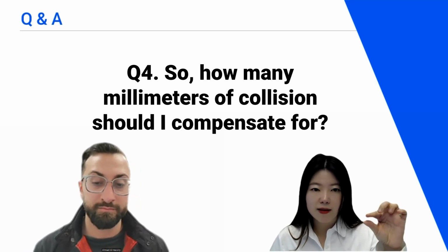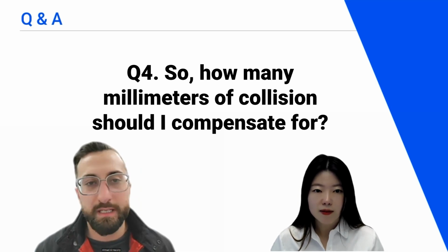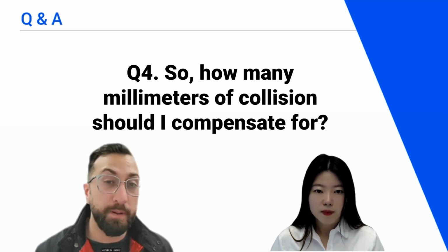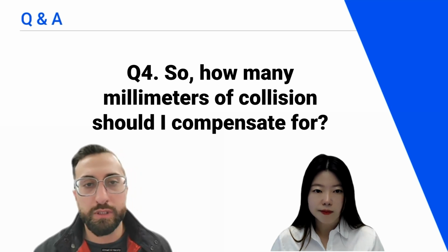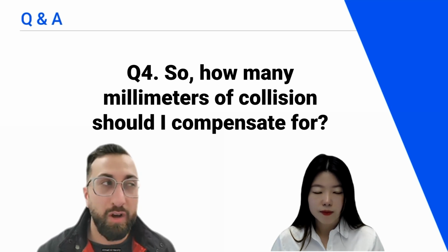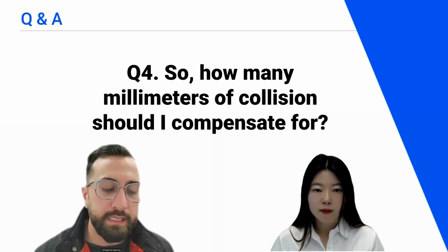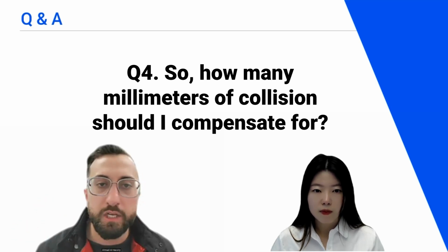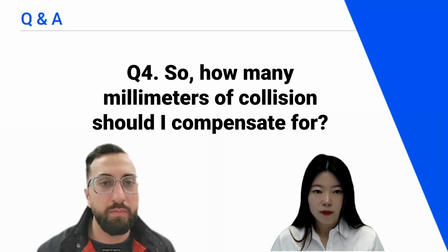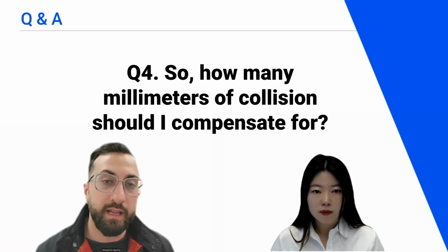So you think that less intersection is quite okay? Yeah, a little bit. If it's a little bit of spots here and there, I really don't find this to be super significant clinically. Of course, it's going to depend case by case, and honestly, have that discussion with your lab about what they're comfortable with. But I don't really see these little tiny spots of intersection being an issue. I accept those. It's more so where it's like 2 millimeters, 3 millimeters, and an entire quadrant. That's when I see an issue.